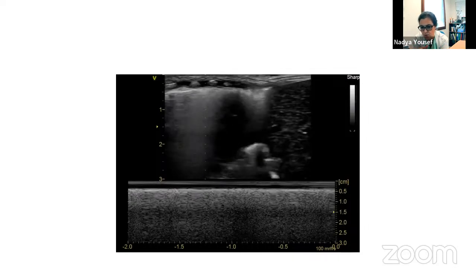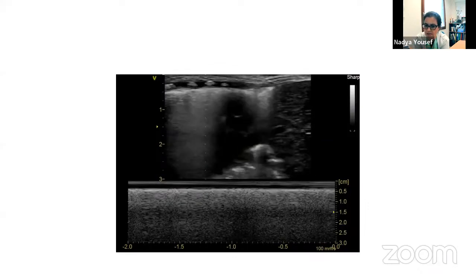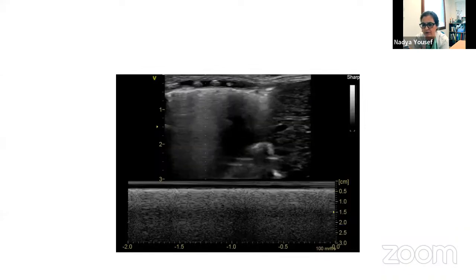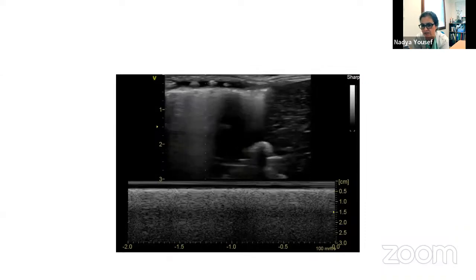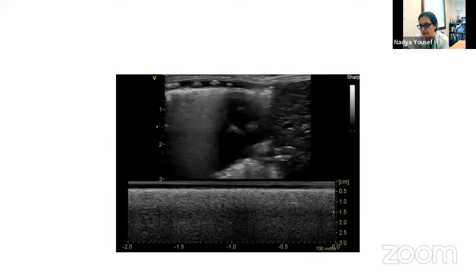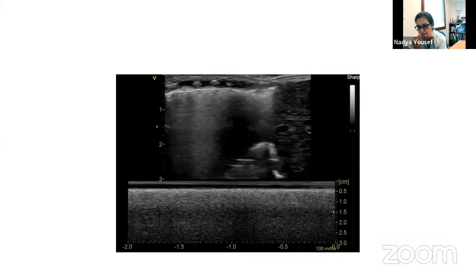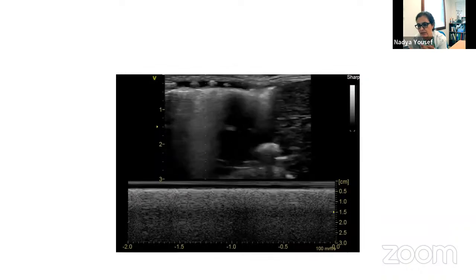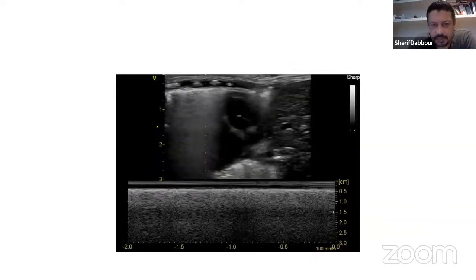But in any case, you have movement there. There is absolutely no sign of no lung sliding or no movement. Of course, it looks a bit different because I think you have the lung pulse with it, so the sliding is kind of mixed up. It's right beside the heart. If you do not have any movement of any kind, lung pulse, lung sliding, then in the time where you don't have these movements, you would see the same thing where you see between 0 and 0.5 centimeters all the way down. Okay, I see.